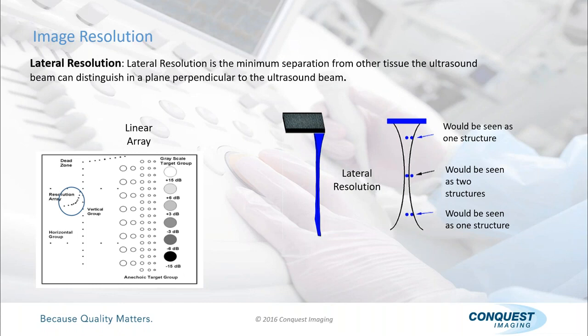All right, any questions on axial and lateral? Top to bottom, left to right. Okay, so I know it's hard to see, but on these objects here, can you tell me whether that is poor axial or poor lateral resolution? Anybody? Poor lateral, because the dots on the left kind of are the 2 or 3 dots or whatever, they're kind of one. Yeah, you can't even really tell how many there are there? So yeah, it's poor lateral resolution.